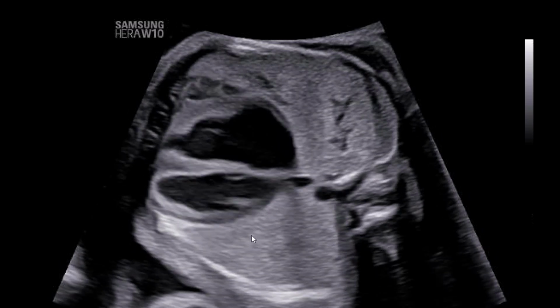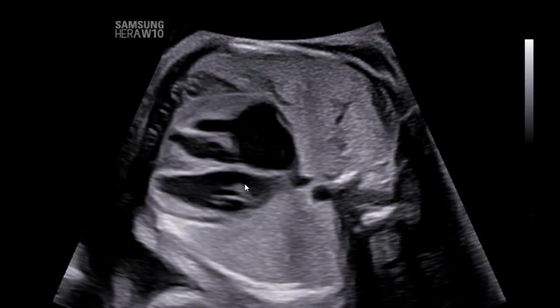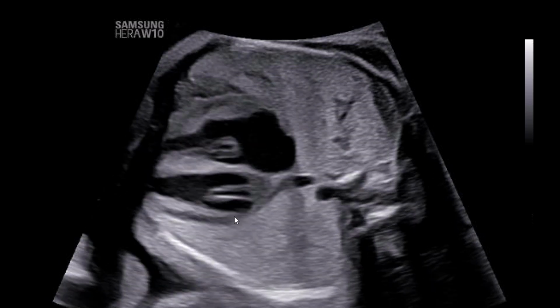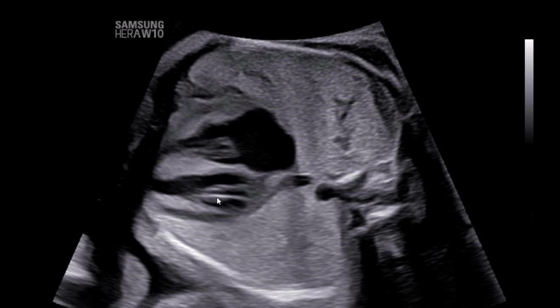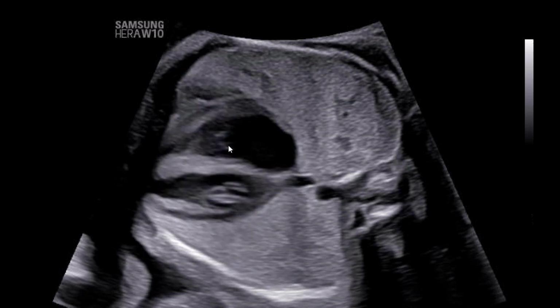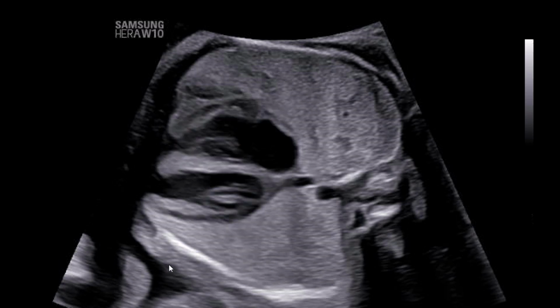Now here we have the 4-chamber view, and we can see both atrioventricular valves. We identify this as the right ventricle, which is on the right and more anterior, based on this trabeculated apex with a moderator band, and then the morphologic left ventricle with the smooth septal surface, fine trabeculations, and these two papillary muscles here along the free wall. And so this is a mitral valve, and this is a tricuspid valve. And in this view, it looks like the ventricular septum is mostly intact.